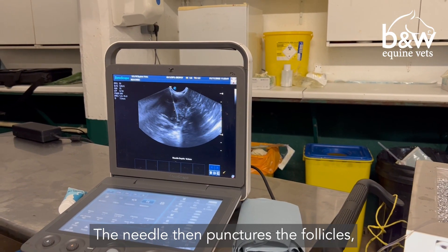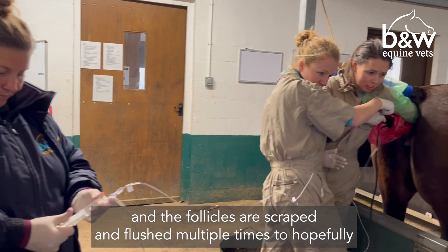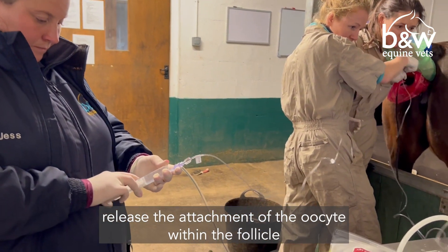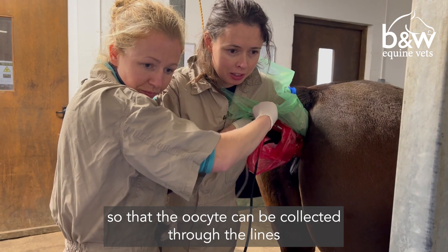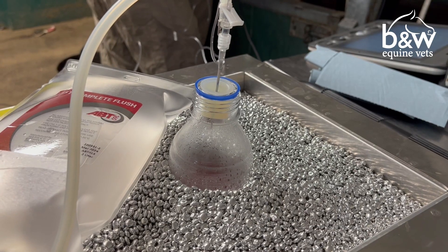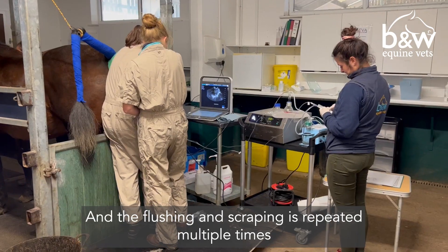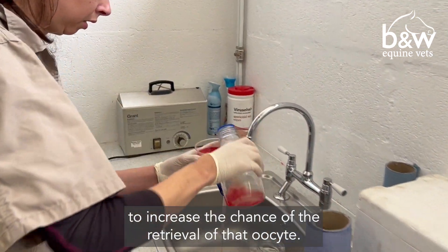The needle then punctures the follicles and the follicles are scraped and flushed multiple times to hopefully release the attachment of the oocyte within the follicle, so that the oocyte can be collected through the lines and into a temperature-controlled bottle. The flushing and scraping is repeated multiple times to increase the chance of retrieval of that oocyte.